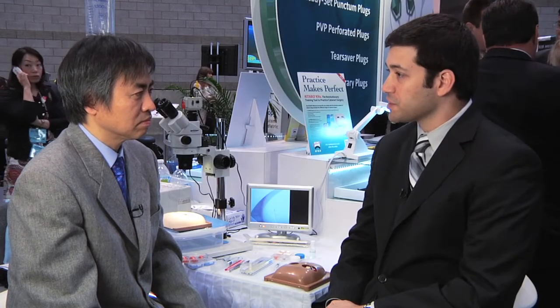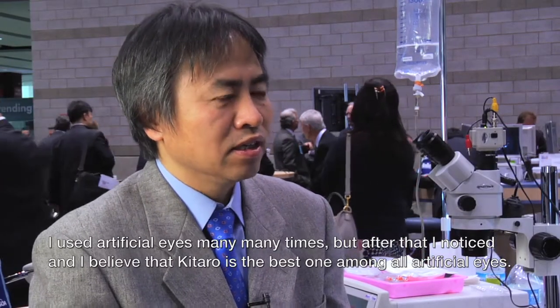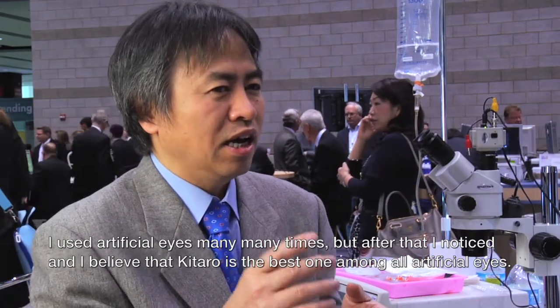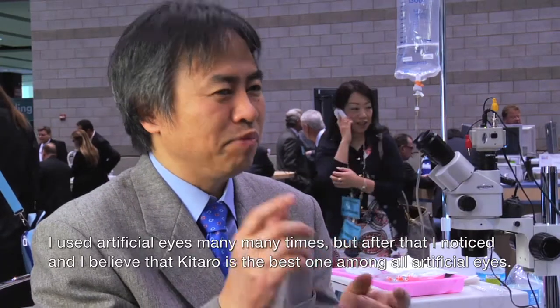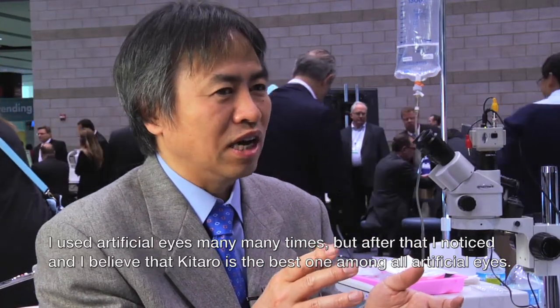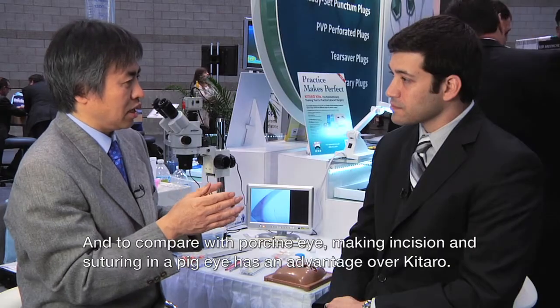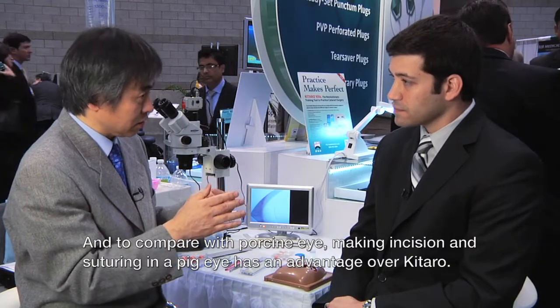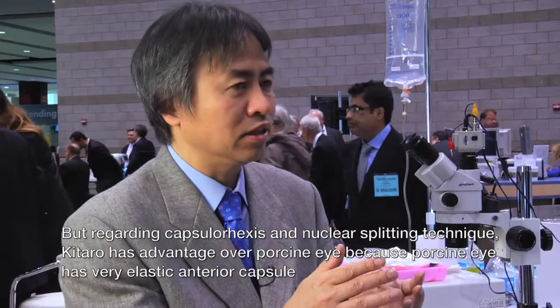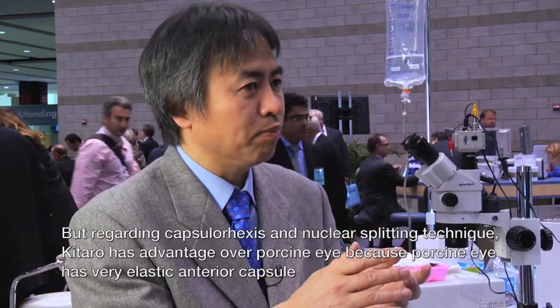How does the Kataro kit compare to traditional practice models such as pig eyes? I used many kinds of traditional artificial eyes, and I believe Kataro is the best among them all. Compared to porcine eye, pig eye has an advantage over Kataro regarding making incisions and suturing. But regarding capsulorhexis making and nuclear splitting technique — which is a very important part in phaco surgery — Kataro has much advantage over porcine eye.